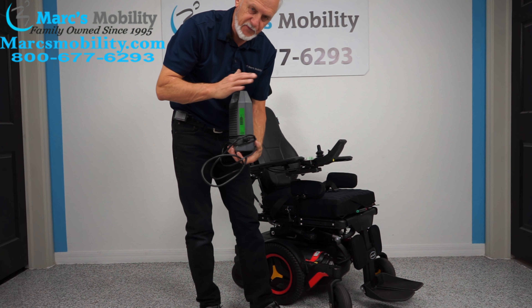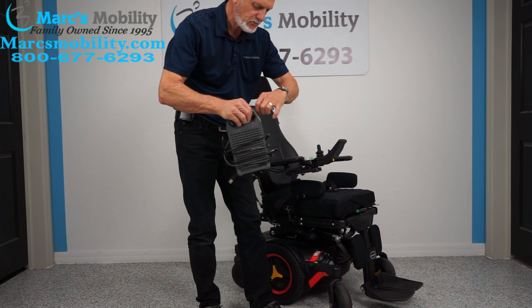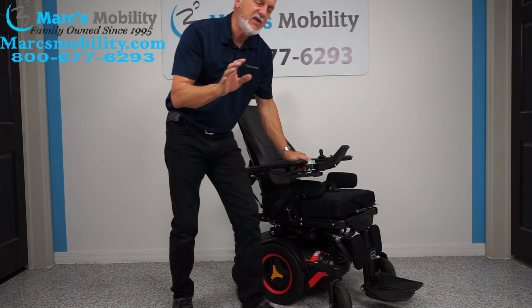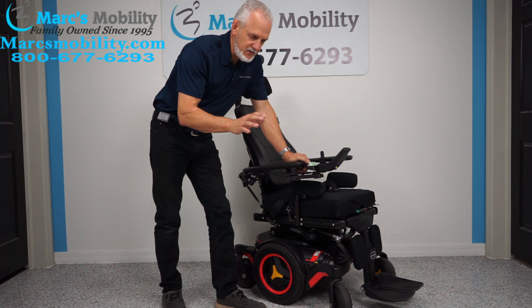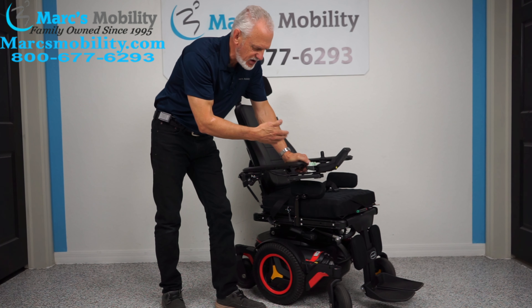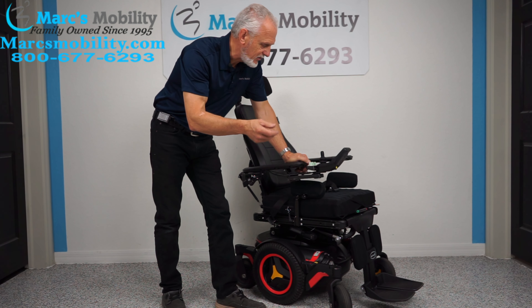To charge the batteries, take your Permobil charger and plug it in right below the joystick. Once it reaches 100%, it's fully charged. There are two batteries in this chair that give you up to 15 miles per charge. That distance depends on terrain, user weight, how you drive, and how many functions you use — so you may get more or less than 15 miles.